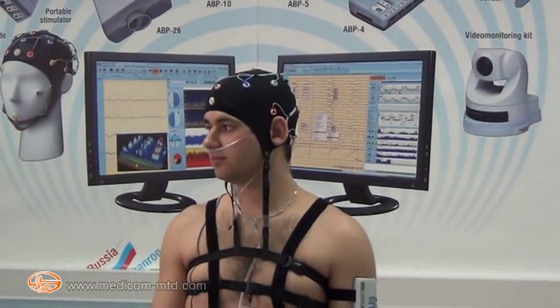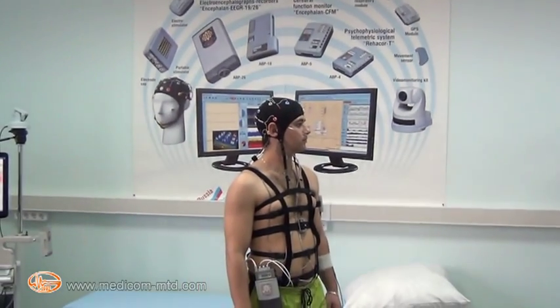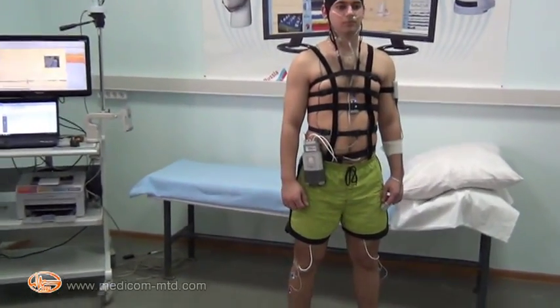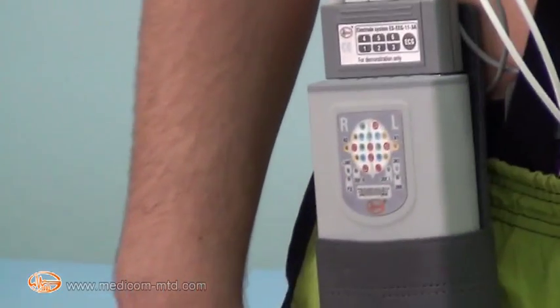Medicom MTD presents a system for polysomnography based on the electroencephalograph recorder Encephalan EGR-1926 version AT-PSG video with electrode system ES11.